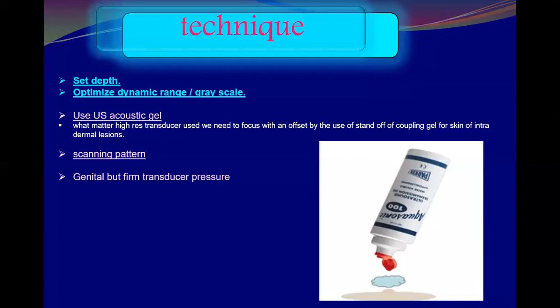After we know how to optimize space and position, we know to scan the breast from the clavicle down until no breast tissue could be seen inferiorly or caudally, laterally going to the mid-axillary line, medially to the midline, where the two breasts are abutting each other. Then we would like to know what the techniques are to image a breast.